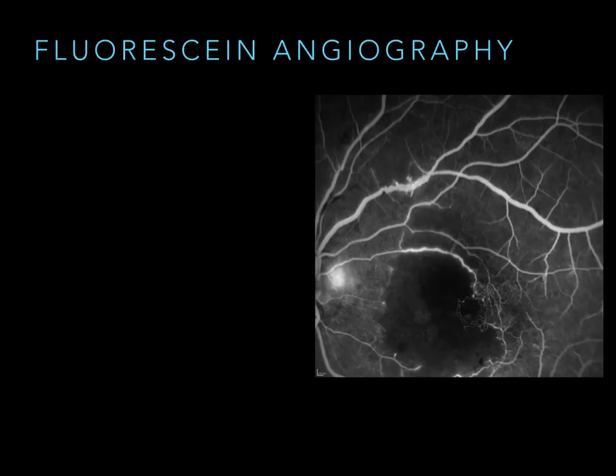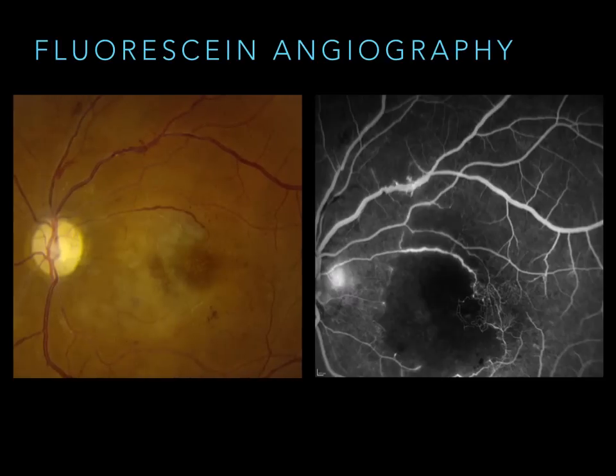Here we see abnormally bright at the disc. Abnormally dark in the macula, right? You can see this little kind of web-like ring around where the foveal avascular zone is. And oftentimes before you commit to a diagnosis, you need to see the color. Because theoretically, you might say, well, it's dark, but could it be a blocking defect? Well, probably not. Just looking at it, the vessels are all pruned off. It's going to be a filling defect, right? And looking at this, you go, okay, there's not a big chunk of hemorrhage right there. So this area in the center that's hypofluorescent, that's a filling defect.